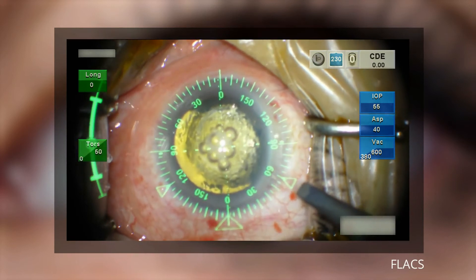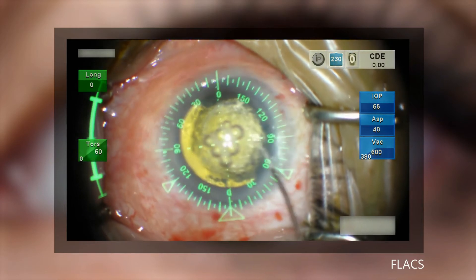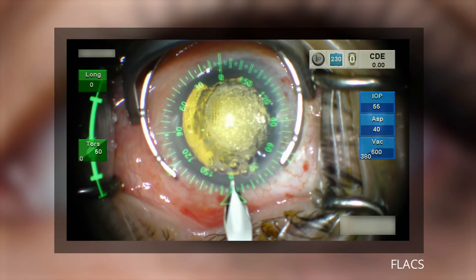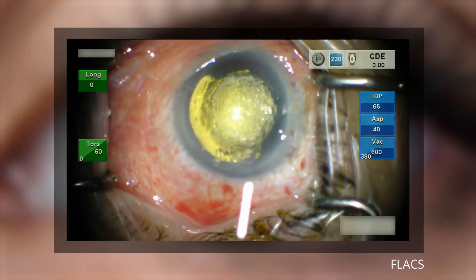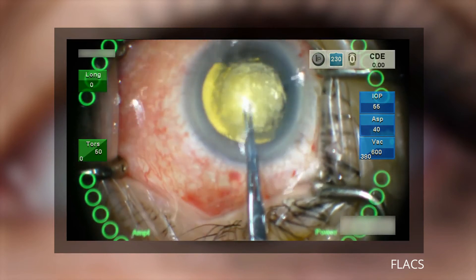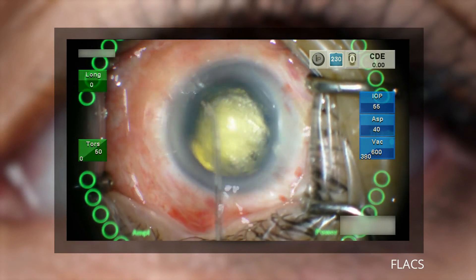If the laser performs the capsular rexa and lens fragmentation, as with the conventional surgery, the surgeon performs paracentesis at 60 degrees and 120 degrees using the guidance of the image-guided system. OVD is then inserted. The main incision is made at 0 degrees, and the capsulotomy cap is removed using forceps. A full hydrodissection is performed, separating the lens from the capsule and rotating the lens to ensure separation.